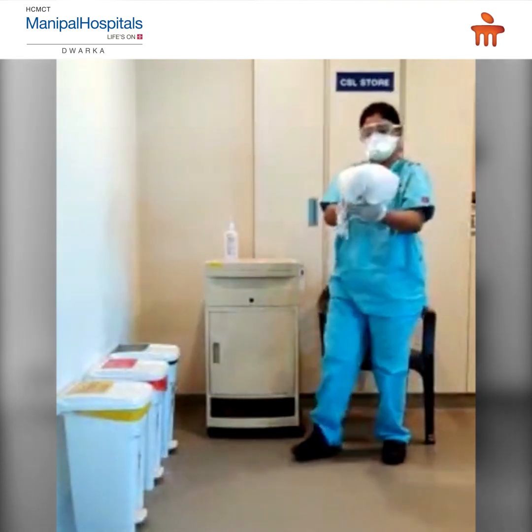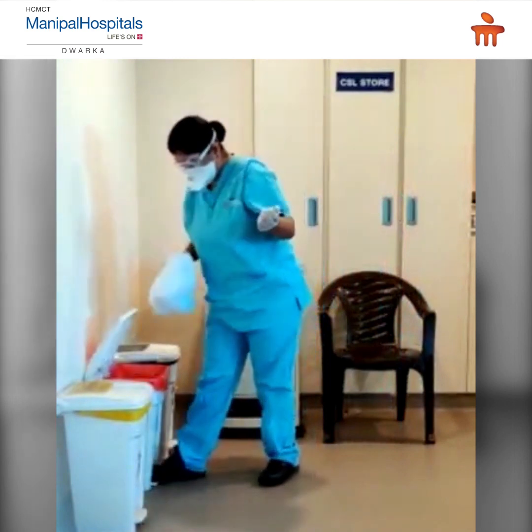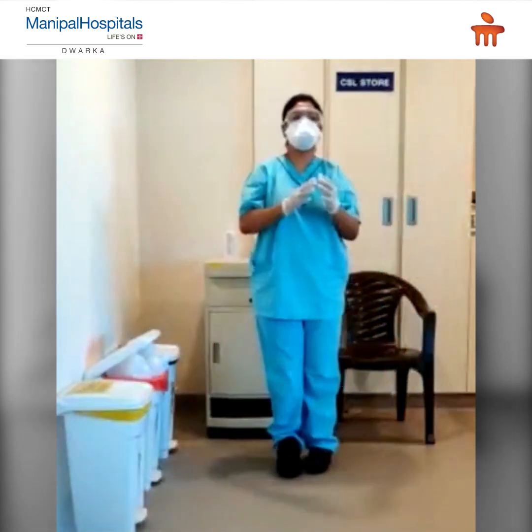Discard your coverall gown in the red waste container. Perform hand hygiene.